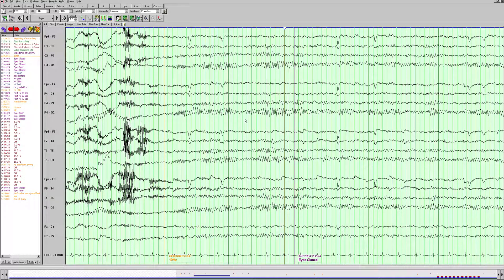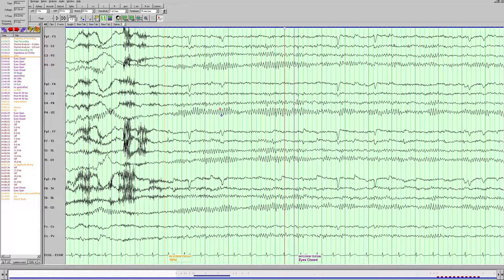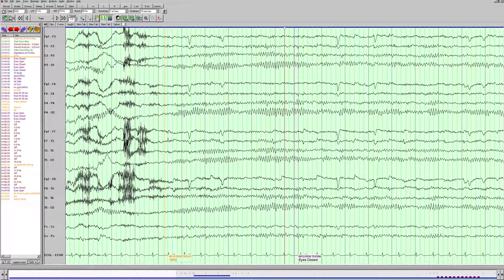The next thing we want to look at is the background amplitudes. We can measure with our measuring tool here — the voltage is about 37 microvolts at the largest, and the smallest is probably about 10, so we would say between 10 and 40 microvolts. Then we want to look at the symmetry between the sides. The symmetry in terms of frequency is equal, looking nice and symmetric, and the symmetry with the amplitudes looks equal as well.